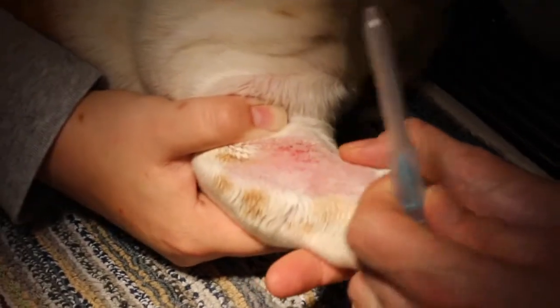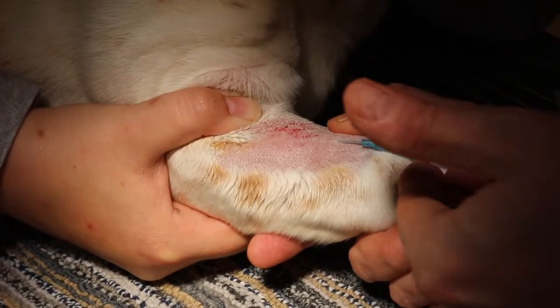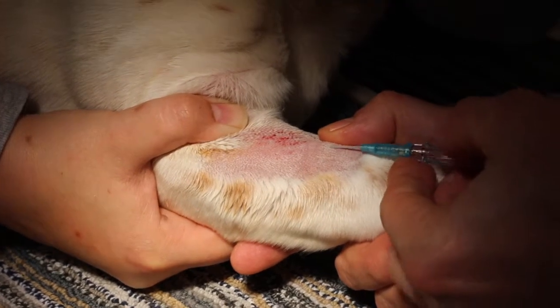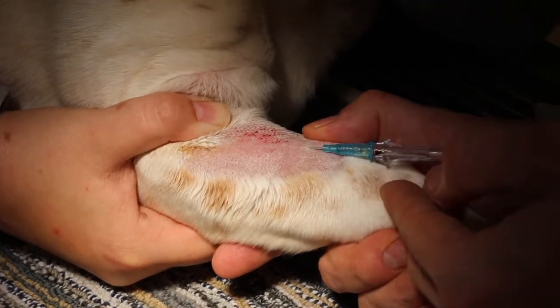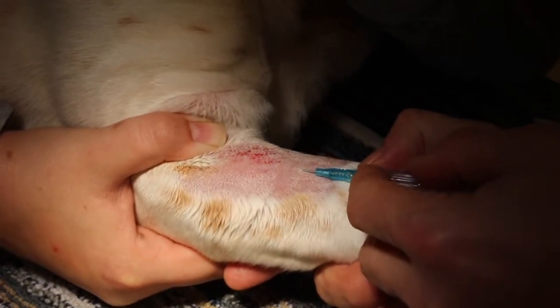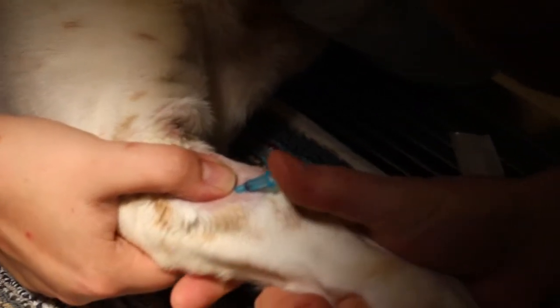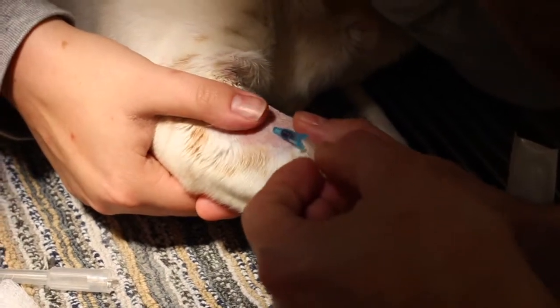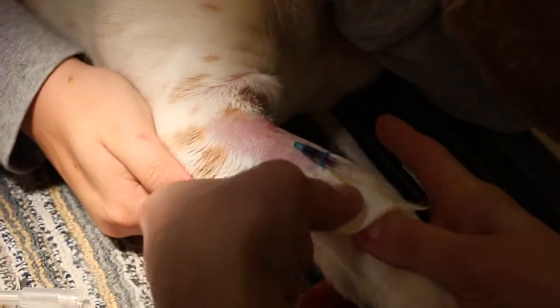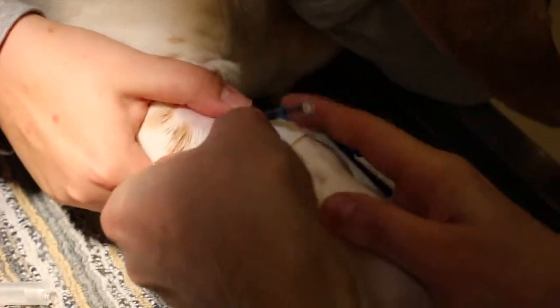I'm going to tense the skin towards me a little bit. Wait for the blood — sometimes it's there and you've missed it. There it is. I felt it pop, it's coming in, it's flowing. I feel confident about the way it went in, so I'm going to just extend that catheter in. It's in there. So the same way — this is how I always do it, because my muscle memory tells me to. I tape them the same way each time.